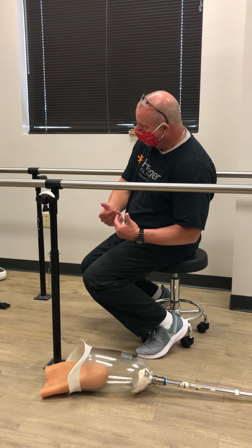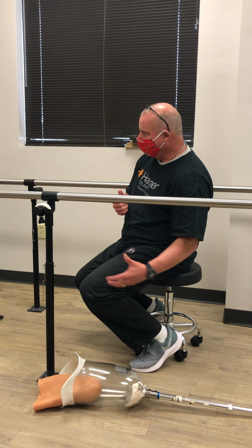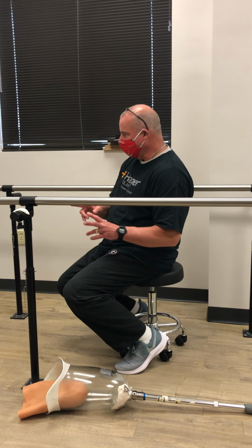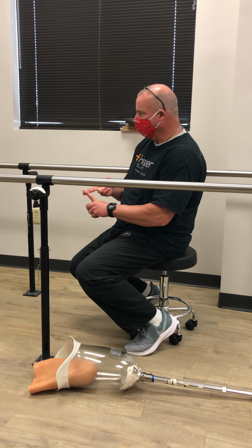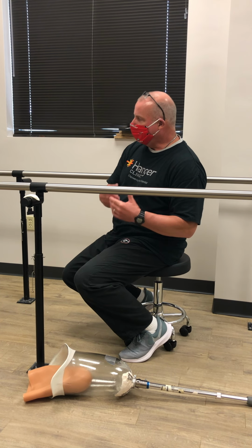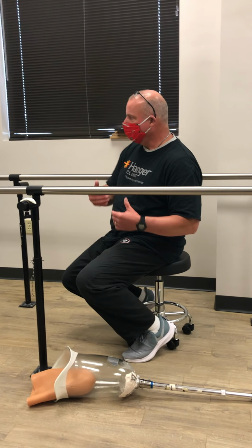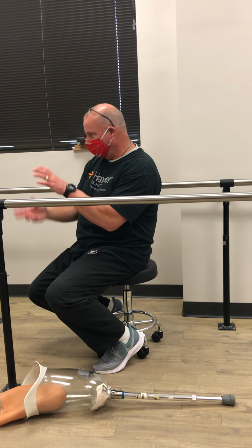Plus, if your socket's not effectively moving when you are, your high dollar knee can't read what's going on because your socket fit is bad. One of the first things Ottobock will tell you, anybody that takes these courses, is two things. You have to have a good fitting socket, and the alignment has to be good before you put the knee under it and program it. Without those, the knee's not going to be able to register appropriately what you're trying to do with it. So those things have to be first, then you program the leg.